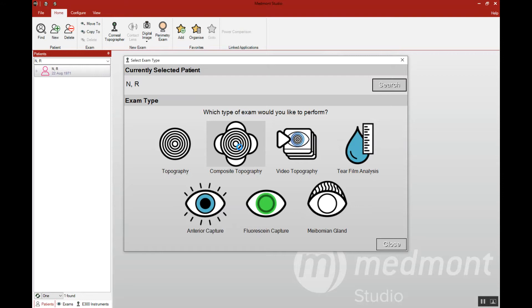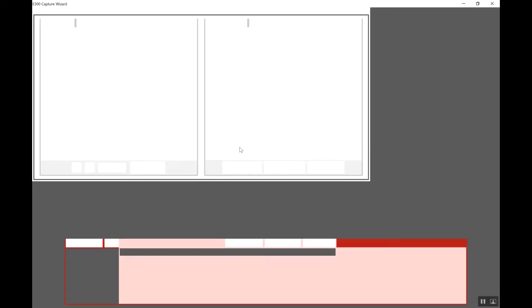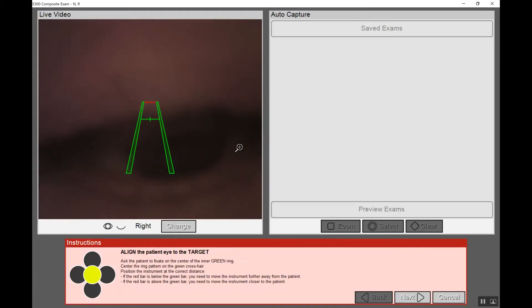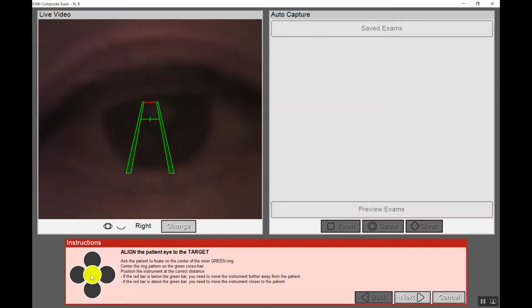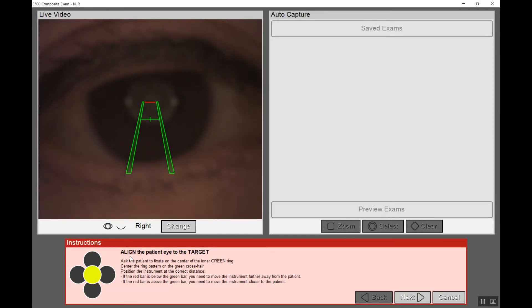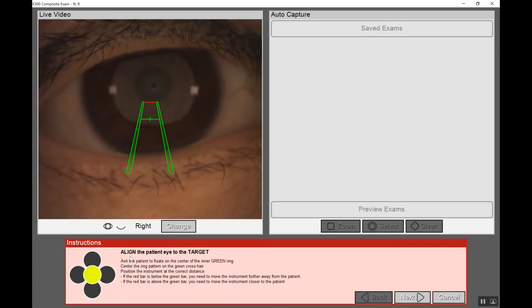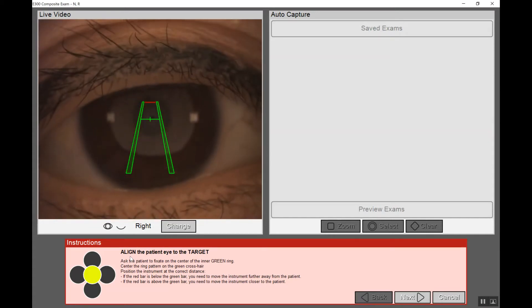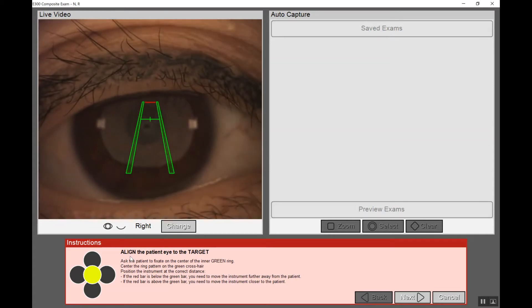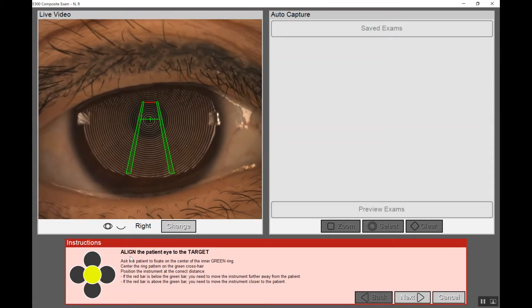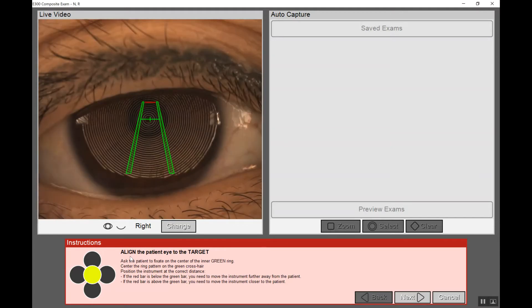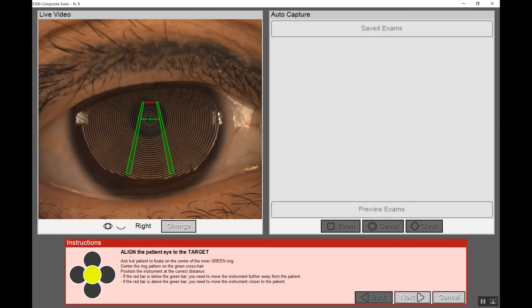When we start the test it's going to give us instructions on where we want the patient to fixate. As an example we can look down in the bottom left and we see the flower with the five different circles. The first that we're going to capture is highlighted in yellow. It's going to ask us to align the patient eye to the target. The patient will simply look right down the axis of the instrument on the center ring and we're going to do a normal capture as if we were taking a single capture.